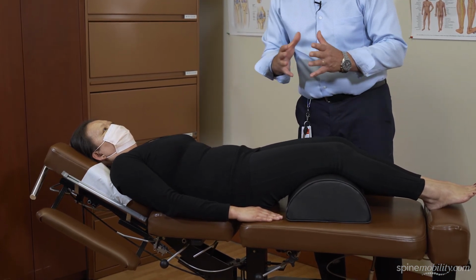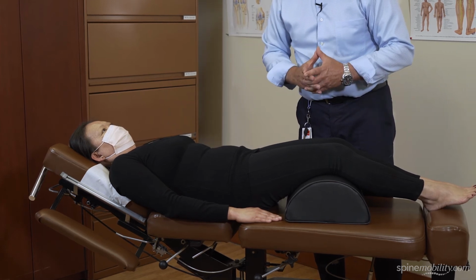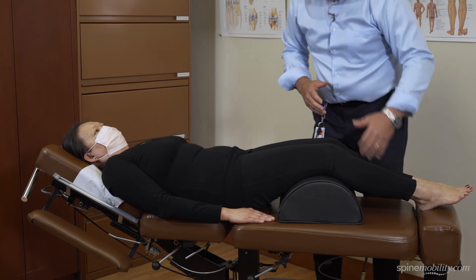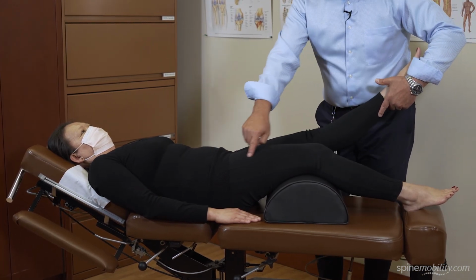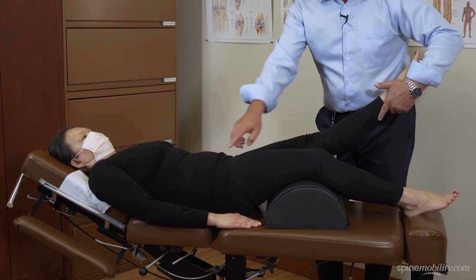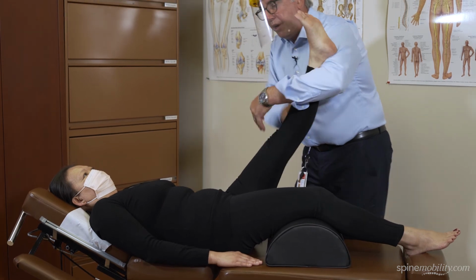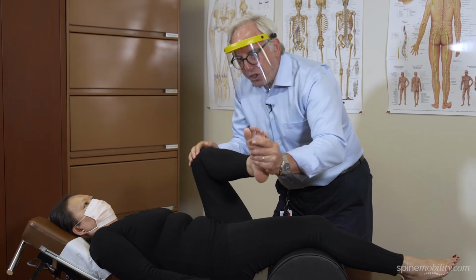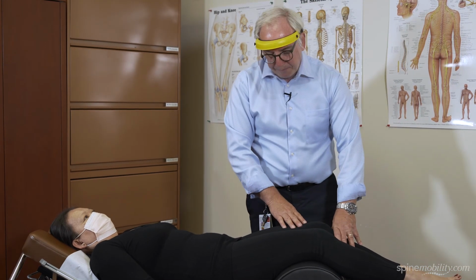It also minimizes facet imbrication for patients who have degenerative back pain, facet syndrome, sacroiliac joint dysfunction, and far lateral disc herniations. So while the patient is in this position, there's also flexion of the knee and the hip, which reduces tension of the sciatic nerve, and reduces symptoms in the leg while you're doing things like neuromobilization, hip flexion, stretching the glutes, all the maneuvers that are outlined in our bootcamp program.